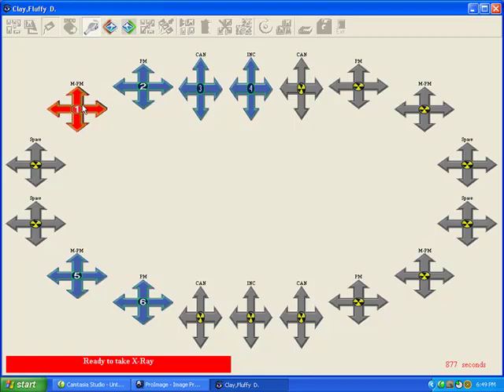When the shot is taken, no matter how quickly, it'll come up in just a few seconds and be displayed here as a thumbnail, and this next in the sequence will turn from blue to red. If you had a bad exposure here, or if you missed the apex, you would hit this repeat. This is a skip forward button. So these two buttons up here really make this sequence very usable and very worthwhile.